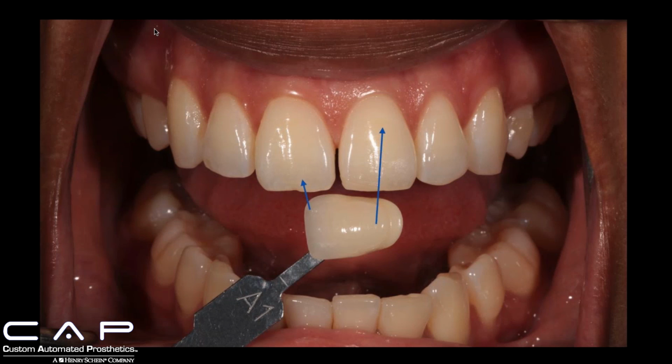So by holding it more at an angle, you have more room to get that A1, or whatever the shade is, label in your photograph, and that way it's just one less thing you have to think about. It's A1. It's right there and it's clear.